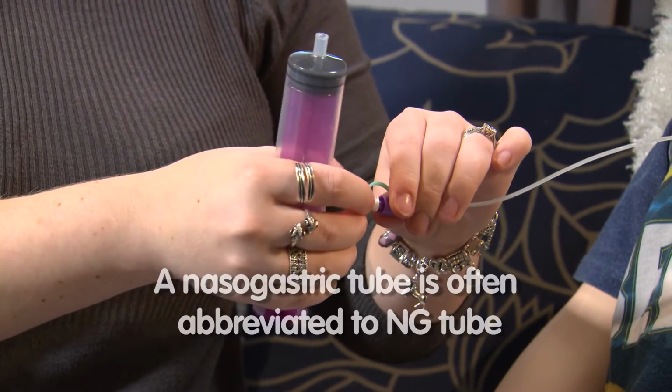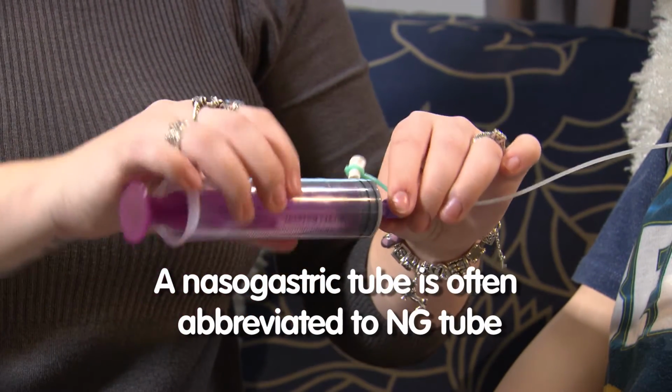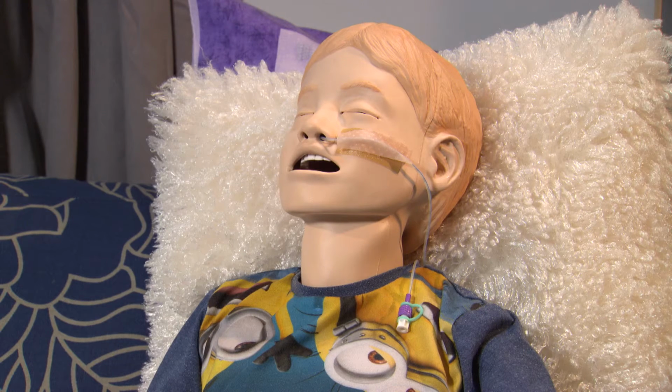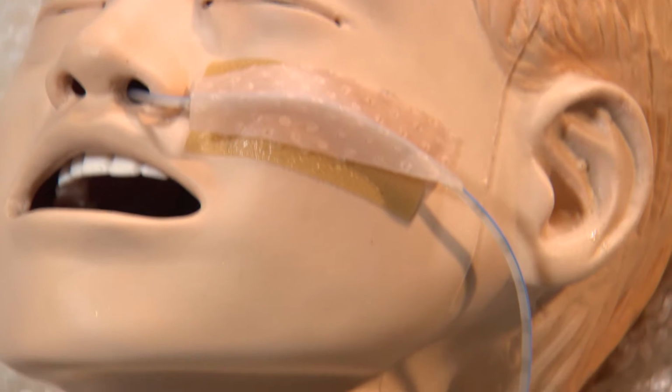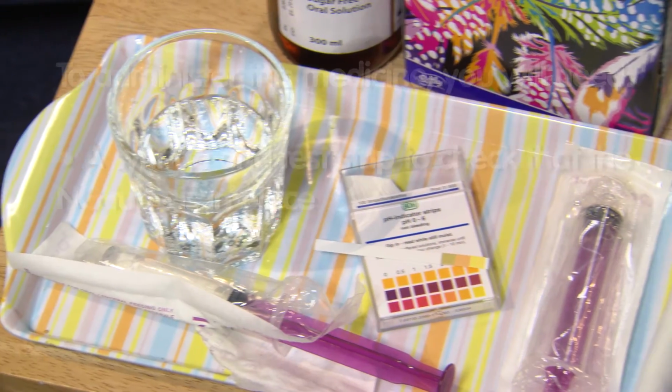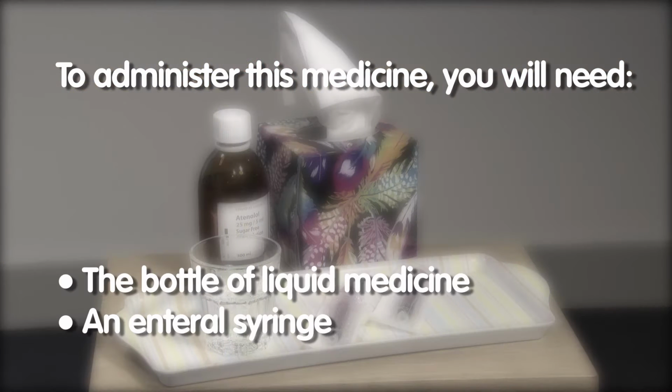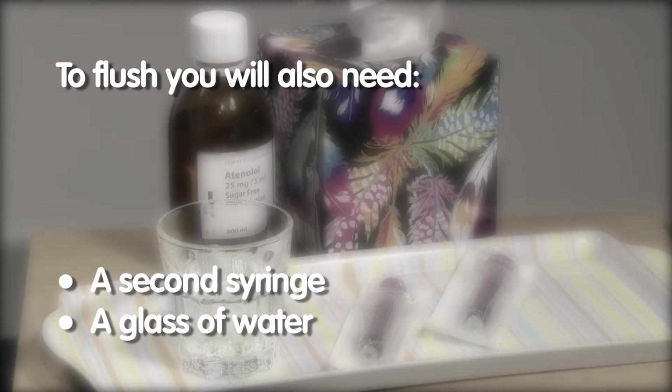A nasogastric tube is often abbreviated to NG tube. You should watch the film all the way through to the end before giving the medicine for the first time. To administer this medicine, you will need a syringe and test strip to check that the NG tube is in place, the bottle of liquid medicine, and an enteral syringe. To flush the tube first, you will also need a second syringe and a glass of water.